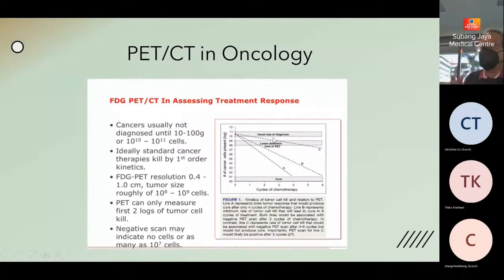So in the cases that we have, be it lymphoma, breast cancer, lung cancers, if the patient has a scan mid-cycle, and if they have good response, they tend to do well. When they come for the yearly scans and so on, the disease tends to be free. But when the patients have a response, some have complete response, some have partial response, almost invariably, eventually, it might be a year or so, something will pop up.